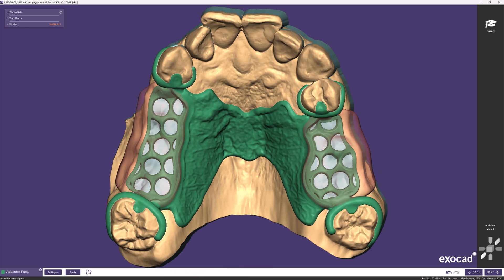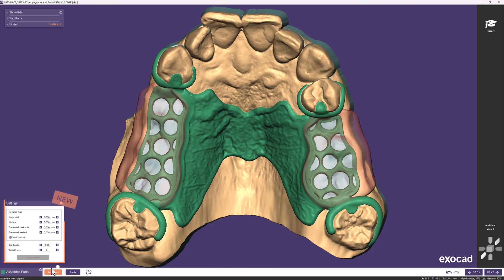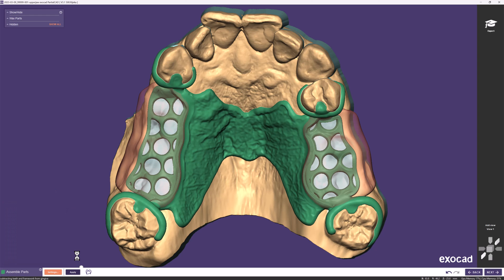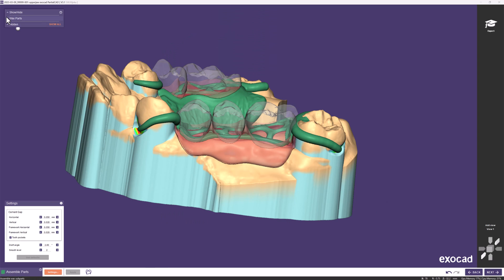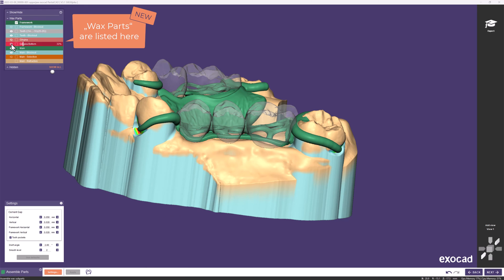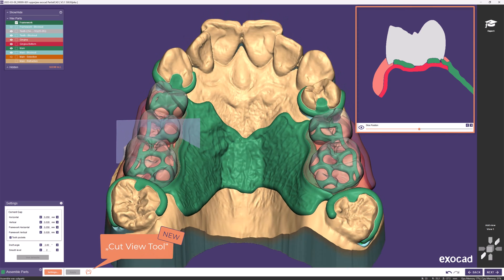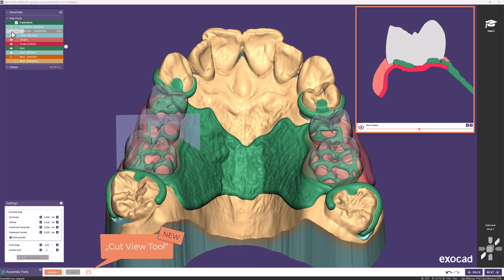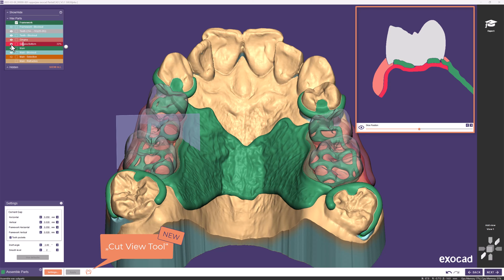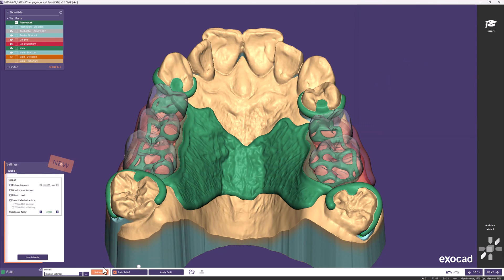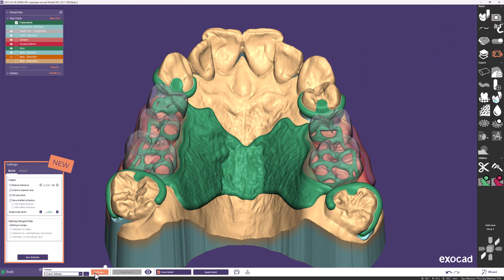The next step, Assemble Parts, is new. Here the calculation of all intersecting elements takes place — for example to create tooth pockets and to split the gingiva into separate parts. After calculation, teeth, gingiva, and gingiva bottom appear in the show/hide menu. You can still modify the partial framework design, but these parts will not adapt to further changes. The new Cut View tool, accessed by clicking the button next to Apply, uses distinct colors to show clearly that the gingiva has been split into two parts that fit together precisely.